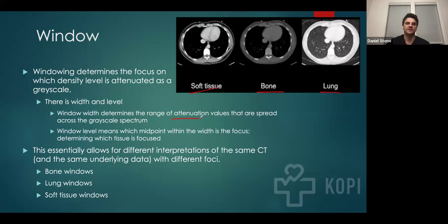There's something called attenuation. And attenuation basically means that the gray scale, or the area where we actually see things as either gray or black or white, is either narrowed or widened.